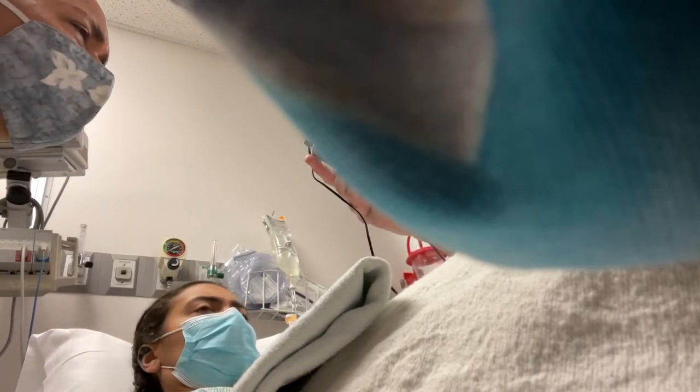That electrical stimulation around your hip — today I will control in recovery and you will control with those dials. You see right now how that zero lines up to those marks right there in front of it? That's how we read it, that's how we set it — that's the off position. When I come into recovery and hook you to it, I start you on number two. We always want to start there. As that anesthesia wears away and pain starts trickling in, as soon as you start to feel pain and soreness, that's when you're turning the dials up and intensifying the stimulation.